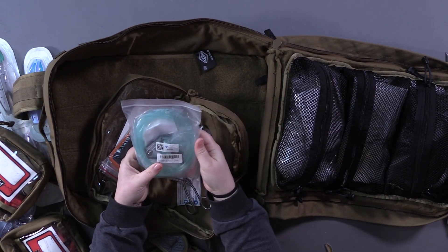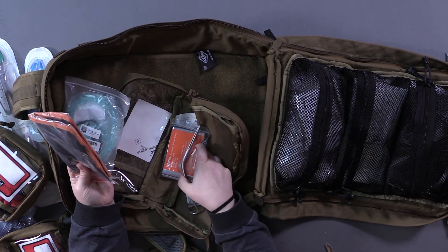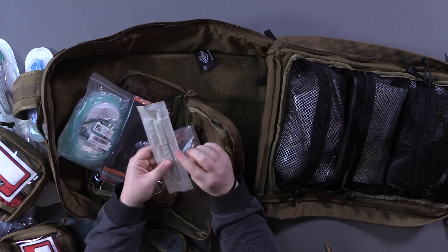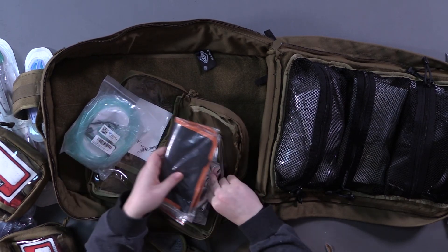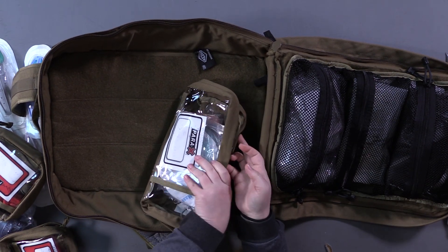Some extra tubing for oxygen, another mask, and a surgical kit — some clamps, a space blanket for hypothermia, and a scalpel. It's just a little mini surgical kit just in case. The tubing can be used for other things but you don't want to do that without training.